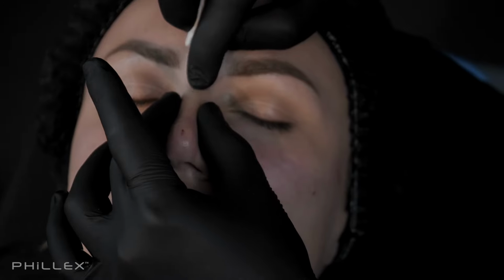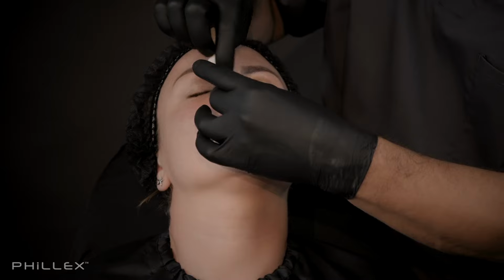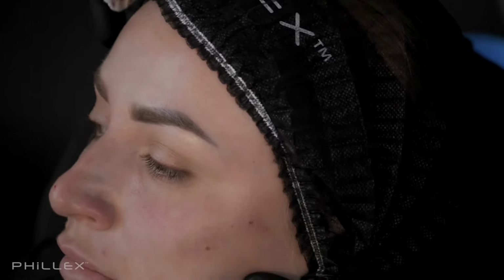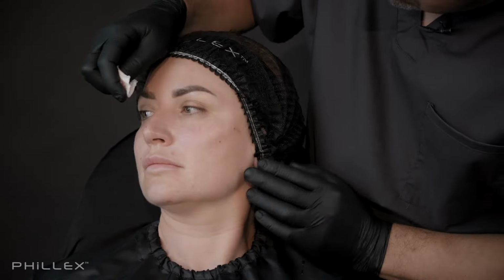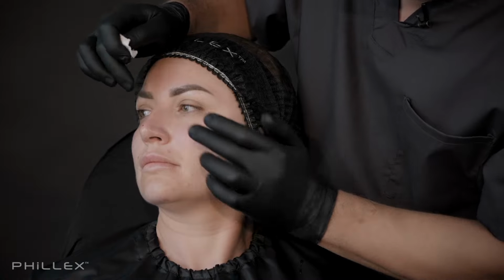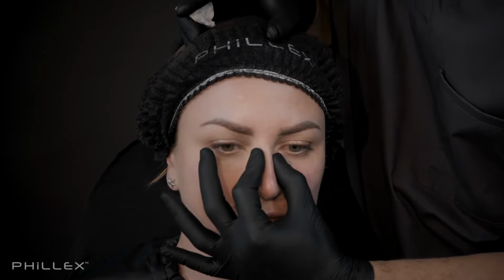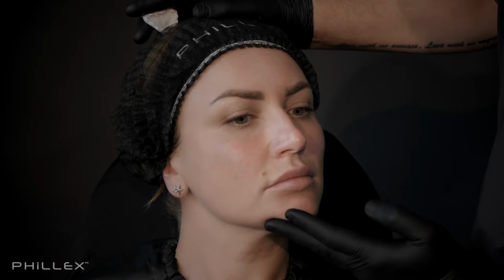The line of the nose will be a little bit thinner. So let us see the profile. As you see, the nose starts to be better, and thinner. I don't think it's necessary to do it totally straight, because there are such words that the best is the enemy of the good.